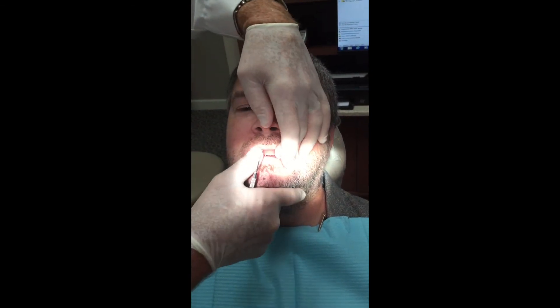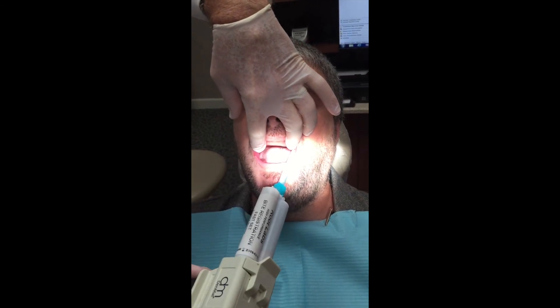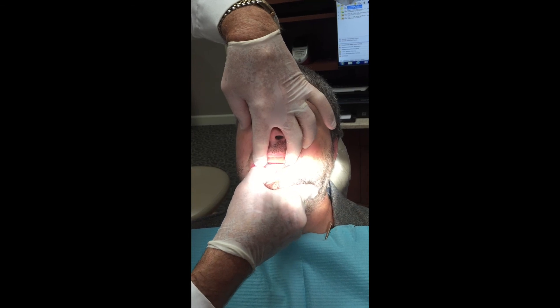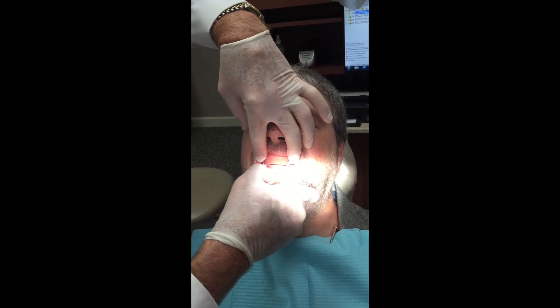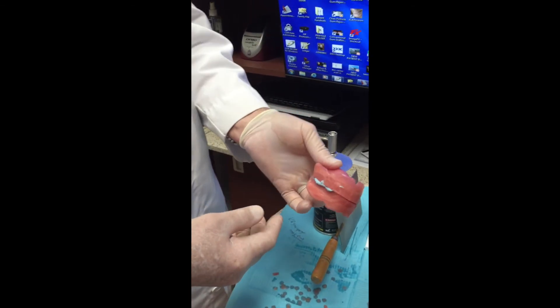Say 66... 77 — what I was looking for. I was looking to see if there was some freeway space, and there was, which you need. Next I'm going to have you bite together when I tell you. This is blue mousse, a quick-setting silicone. Close on your back teeth and squeeze hard. I see my lines are back together — this is my centric relation bite. Without teeth, when patients squeeze hard, most patients will close with the condyles totally seated. There are some patients that will come into a protrusive movement, but Ulysses did a good job. We're using a mark to midline so we have a repeatable centric relation position — very important in dentures that you don't have a malocclusion and that we're in centric relation. This sets for about 90 seconds.